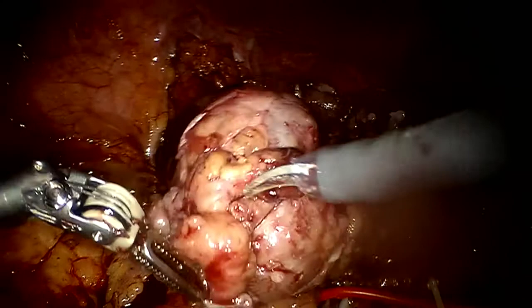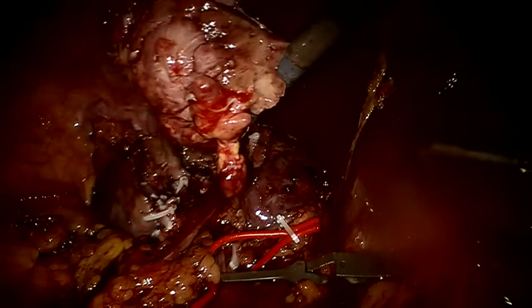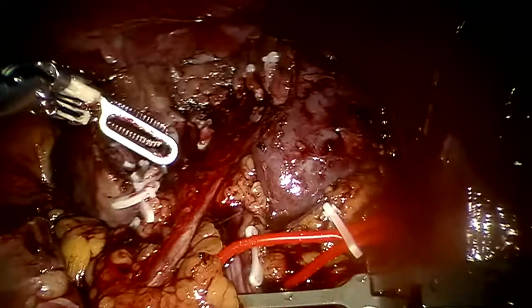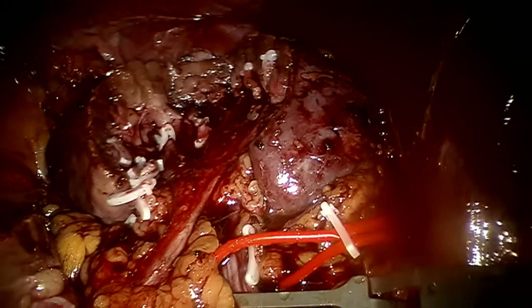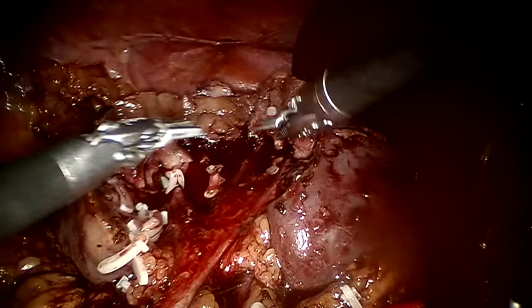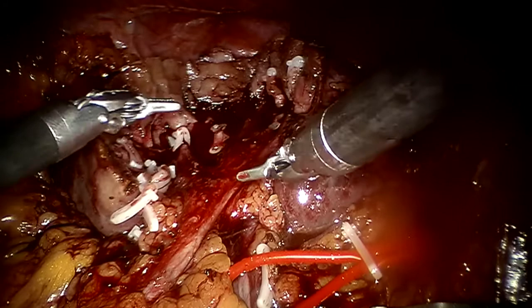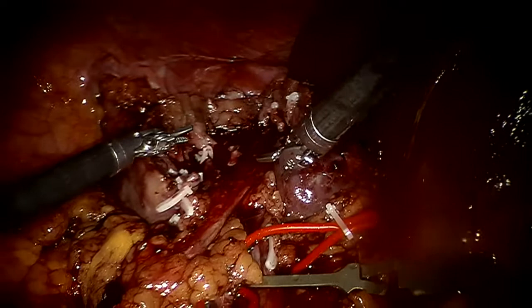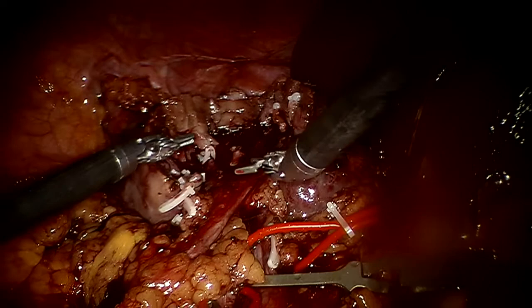Okay, back please. Okay, time so far, guys. 23 minutes of tumor excision time. Here we go. Let's go. It is coming. So in that case, I can't wait. Okay, go ahead. Needle driver. And I'll take the V-lock, okay? So first thing I'm going to do is anchor with a couple stitches, then we go unclamp the vein. Stitch whenever you can. See, these little seconds are not good.